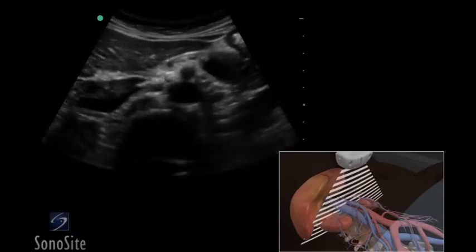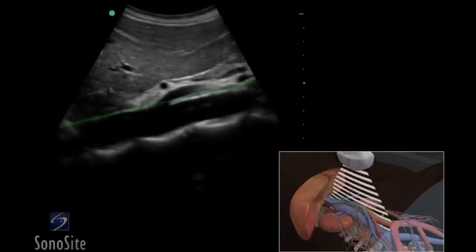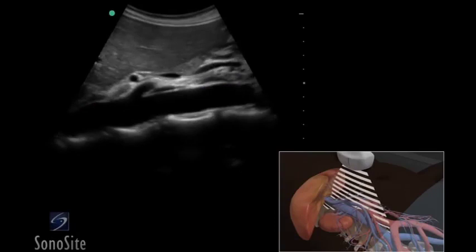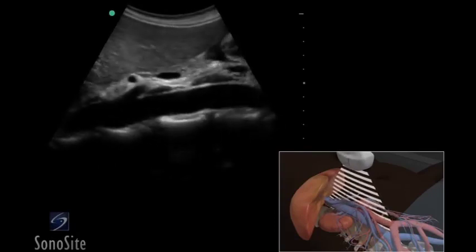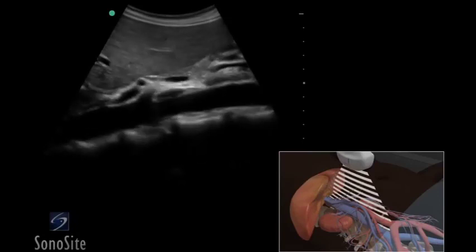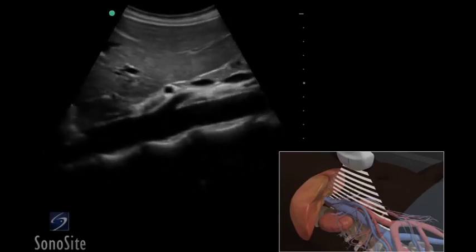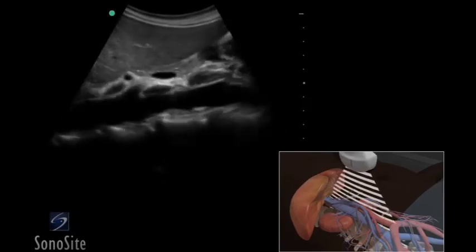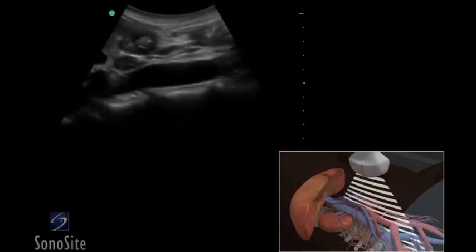The transducer is returned to the epigastric area and rotated 90 degrees clockwise with the orientation marker to the patient's head. The transducer is swept side to side to identify the maximal diameter of the aorta. The abdominal aorta will have proximal to distal taper. The transducer is moved distally to evaluate the walls of the aorta for any change in the shape or size.